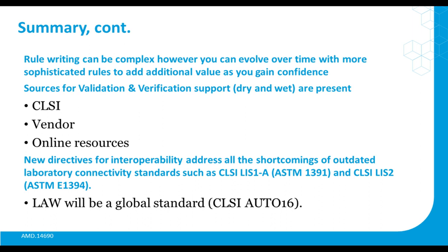It can evolve over time. Some of the rules can be really sophisticated if you study what's done in hematology or urinalysis. Those are meant to be learned from and perhaps extrapolated from, but you don't have to start off with every single thing being automated.